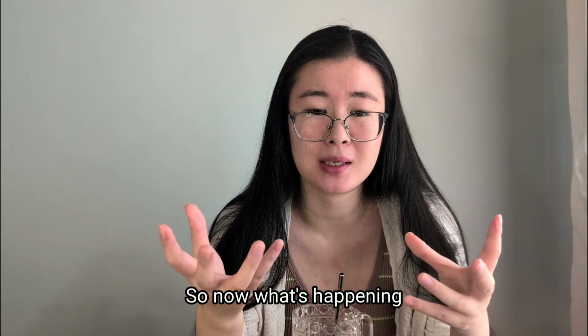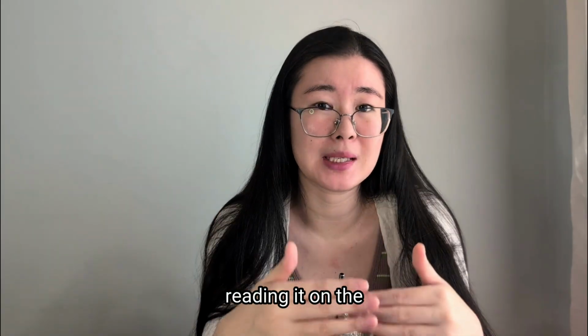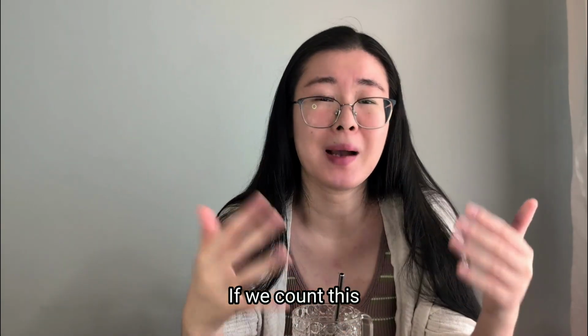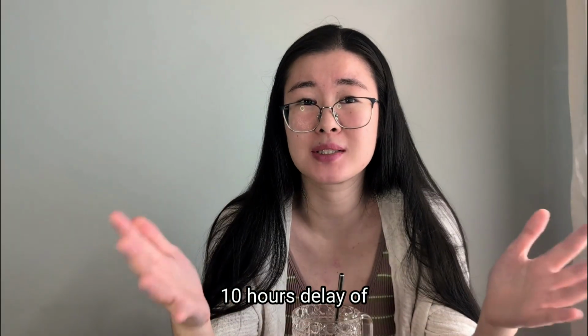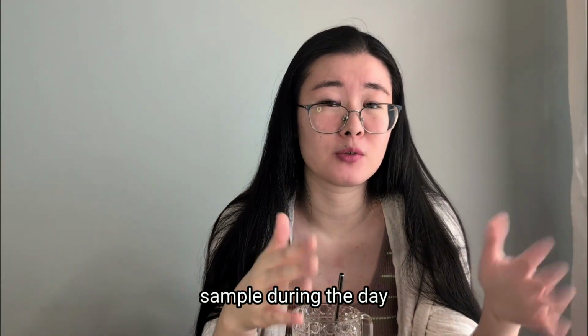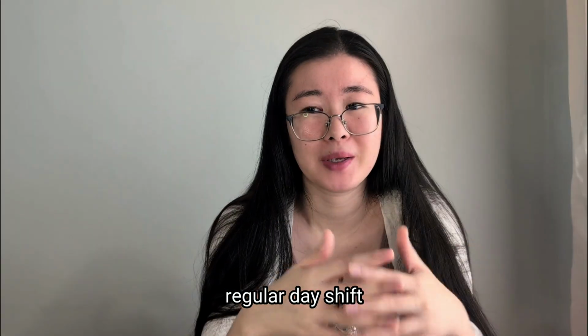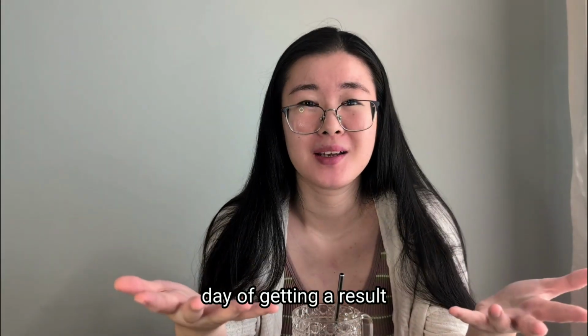So now what's happening is we will put it back into our incubator and hopefully read it on the third day. If we count this by hours, it's probably more like an 8 to 10 hours delay compared to you sending us the sample during the regular day shift. But for the feeling, it would feel like a whole extra day of getting a result.